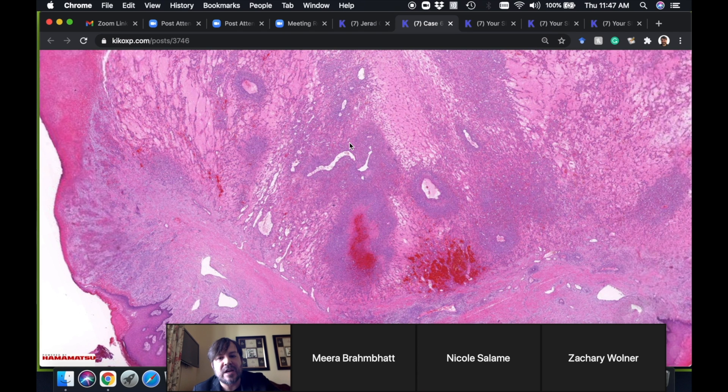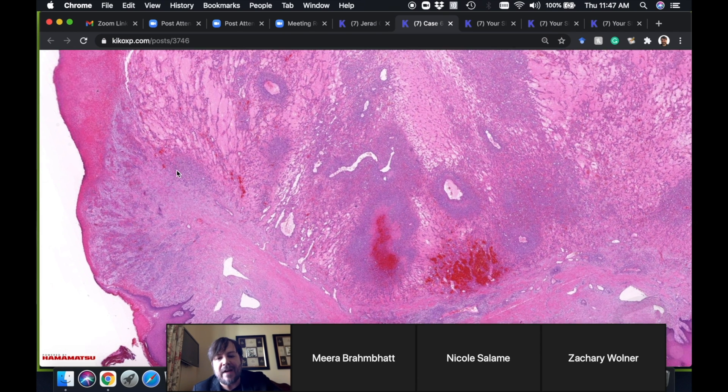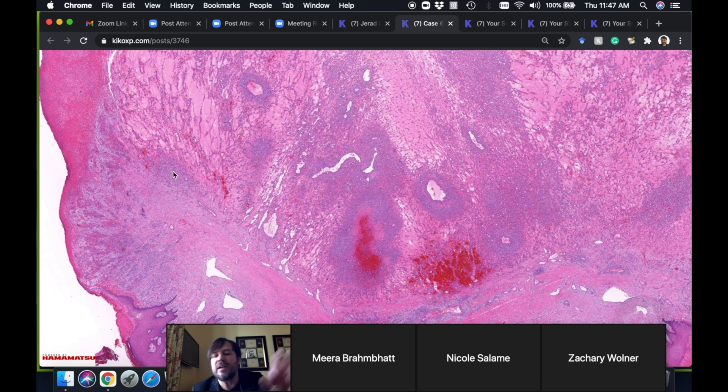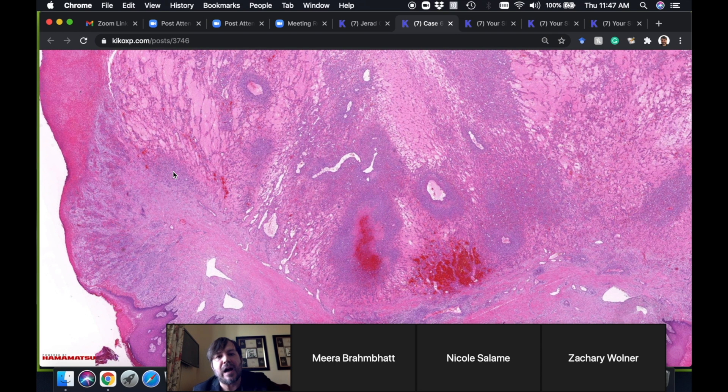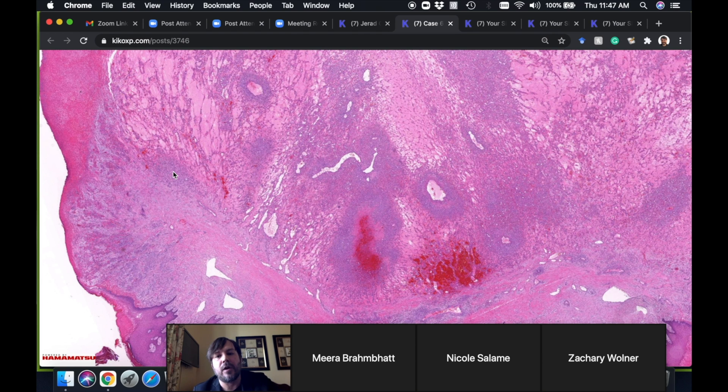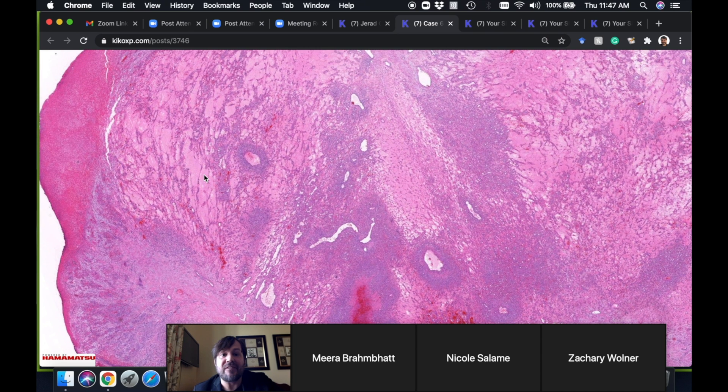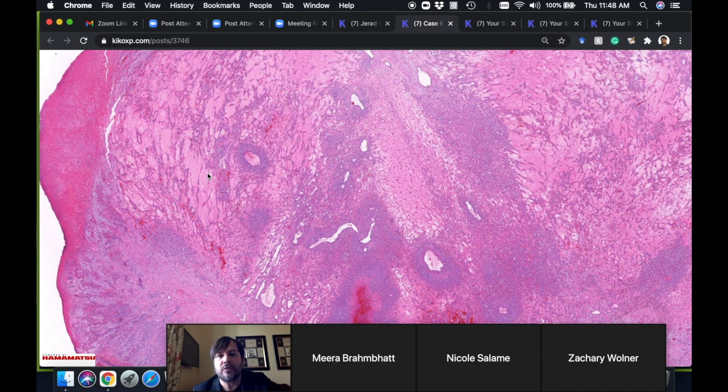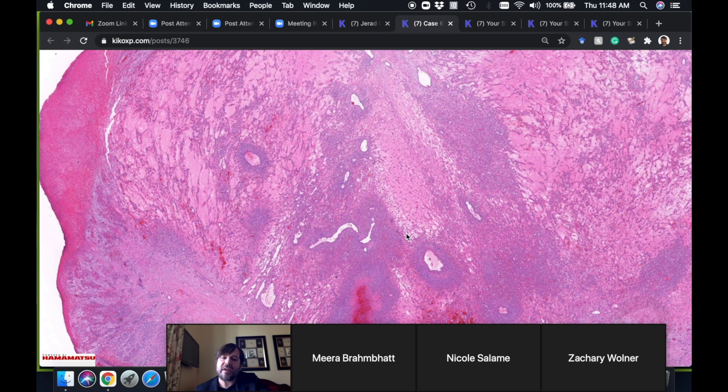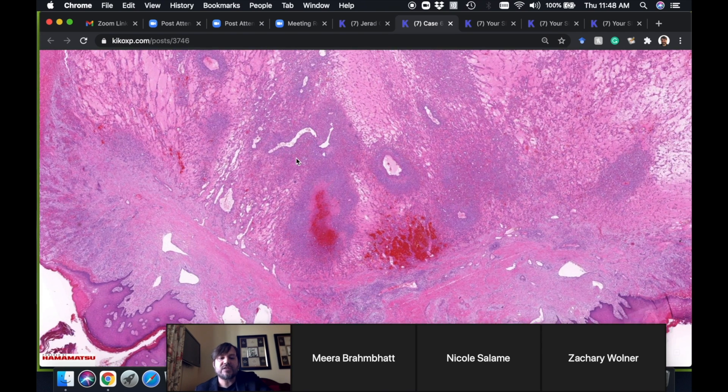Here you can kind of appreciate there's a lobule of capillaries around a central vessel—here's a lobule, here's kind of a lobular shape here. That's really helpful in vascular tumors: the lobularity often goes hand in hand with benign vascular processes, and infiltration sometimes means malignancy, although not always.